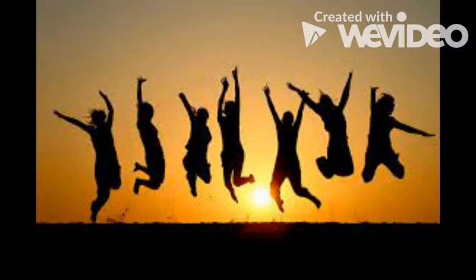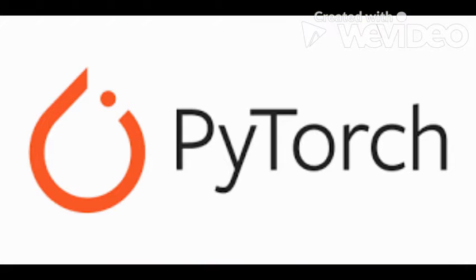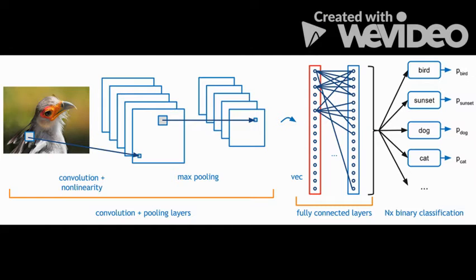This piece of software can help millions of people to get better from various diseases and lead a healthy and happy life. It is so easy to use that not only doctors, but anyone can use it very easily. Palladium is written entirely using Python and uses the PyTorch framework for image classification. A convolutional neural network is used for the purpose of image classification.